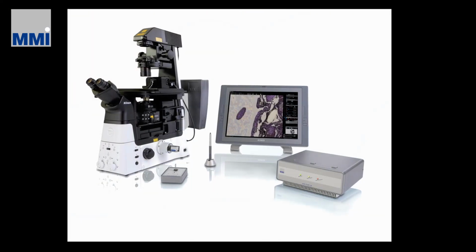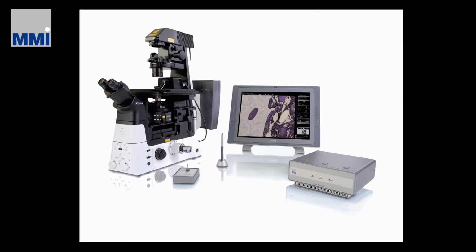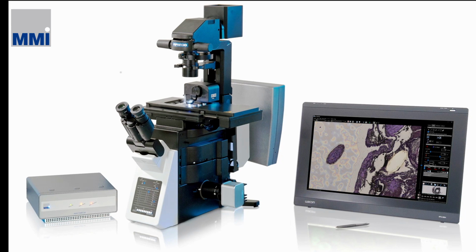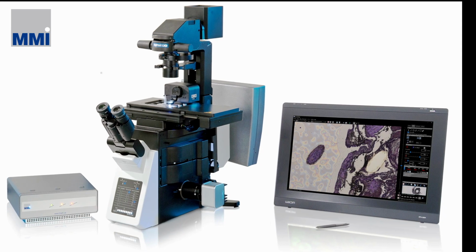In this series of tutorial videos, we'd like to show you the basics of the MMI CellCut and how to get good results for further research. The MMI CellCut is our laser microdissection system designed to cut tissues, large regions of interest or single cells, and even living cells for further processing. With its high-pulse UV laser for precise cutting and the patented CapLift technology for reliable tissue and cell isolation, it will help you with all your laser microdissection needs.